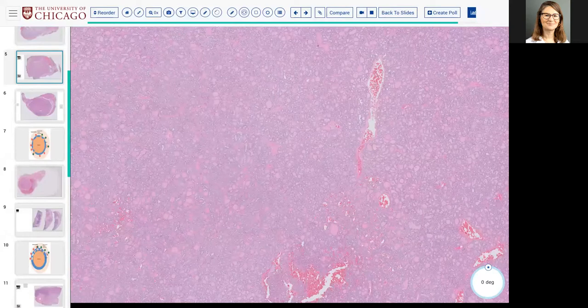So how do you interpret that? A variant BRAF abnormality. Yeah, maybe just not the one that we have the clone for. It's not the BRAF V600E. First, it's not a point mutation, it's a fusion, correct? So the immunostain would not work in this case. Exactly. So whenever I don't know what a genetic anomaly means, I tend to go to the literature, and one of the best sources is the TCGA paper on thyroid.